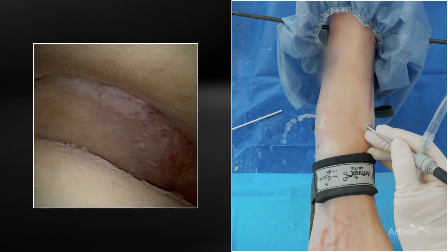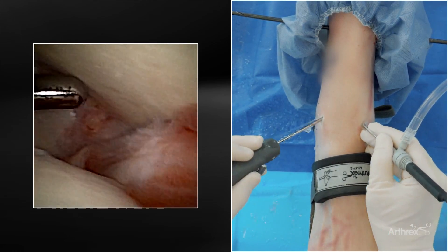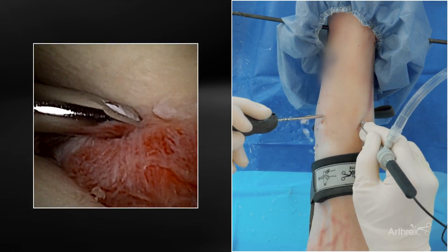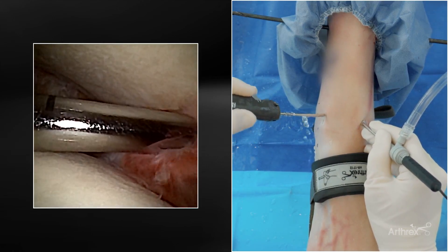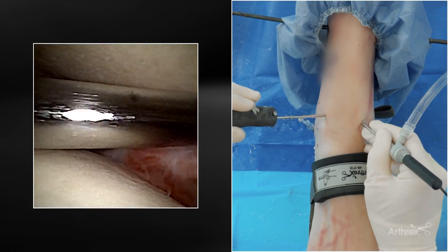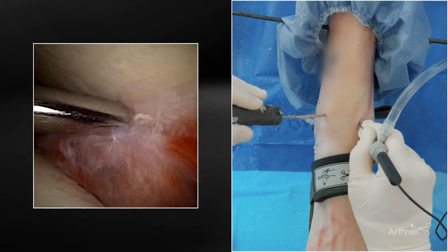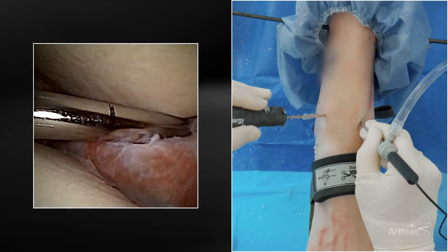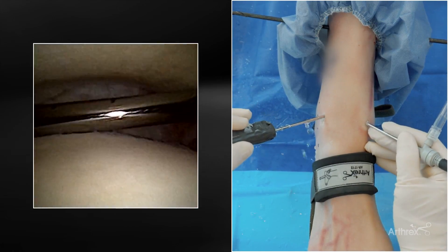I wanted to highlight a couple of things. I usually have a harder time getting towards the back, but this scope is a little bit flexible and we can come towards the back. There's a little bit of pathology — some inflamed synovitis — and you can come back and work. Think about the diameter. Trying to get over the curve of the talar dome and getting towards the back can be tricky, but because these are smaller, it's a lot easier to reach the posterior aspect of the ankle. You can shave, and even though these shavers are small, they are still very aggressive — you still get good suction.